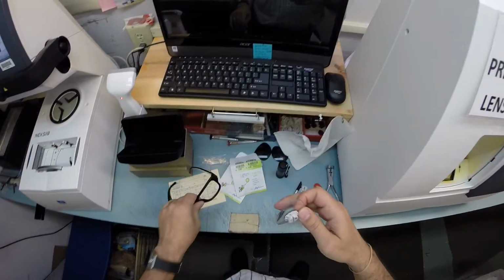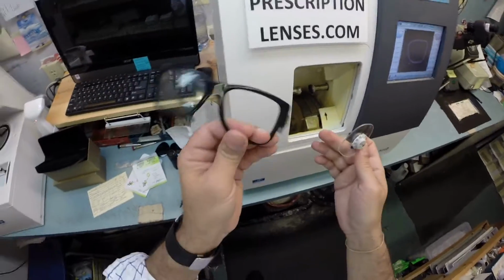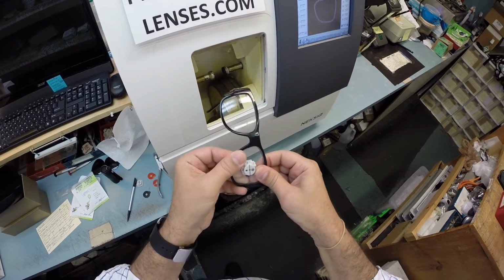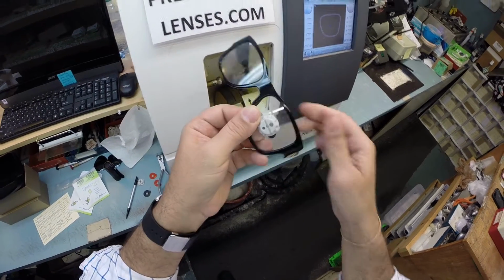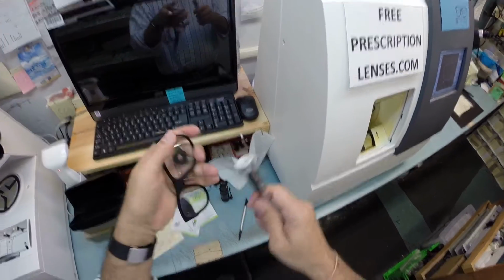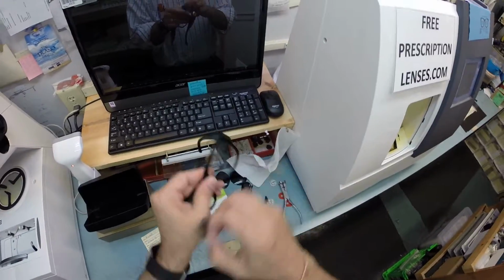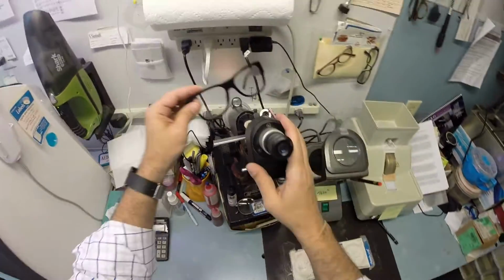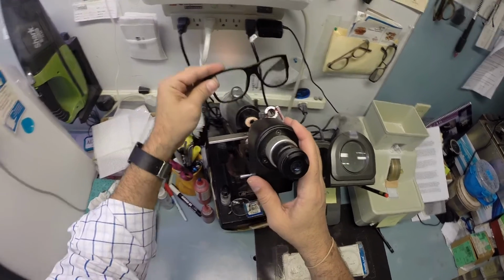And then to mount the lens, I rotate the frame so I have the empty side closest to me. I tuck it in at the outside corner and use my thumbs, press down at the nose, and it snaps right in. So I'm going to take this block, take that off, pull off the sticker, and come down here and clean the frame. Now, if these were prescription, I would use my Marco 101 lensometer to verify the prescription.